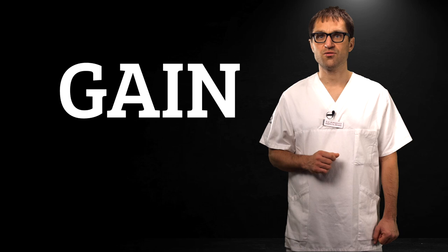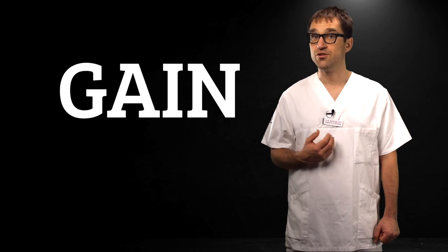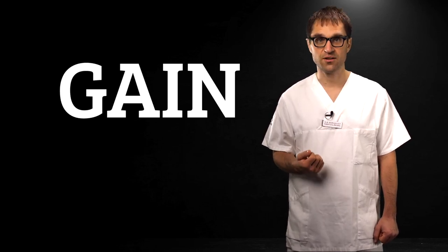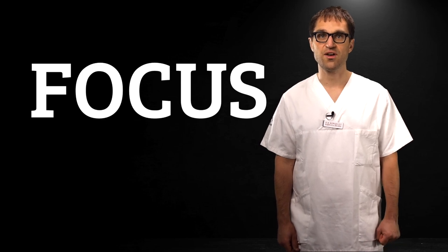With gain, well, this adjusts the signal-to-noise ratio. Basically, if you increase it, you can see your cannula better at the price of more noise. You need to find a sweet spot where both the cannula and the surrounding structures are clearly visible. Focus determines the depth where you achieve the best resolution. If this feature is available, set it to where the action is, usually in the middle of the vein.